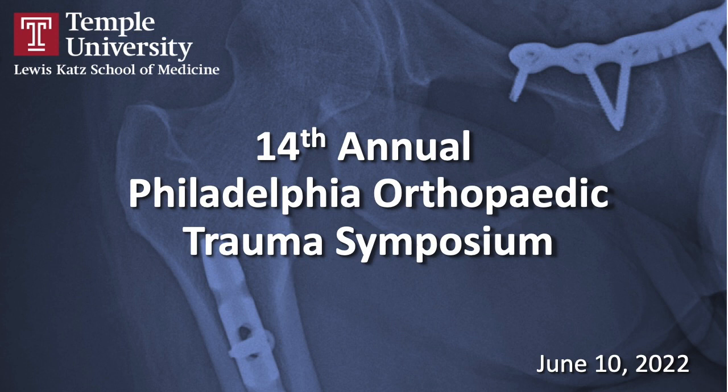That's critical. Okay. In my world, it's partly driven by what the pin sites look like. If you've got a bad-looking pin, that's probably a problem. But if they all look pristine and you've got an A host, a good host, I'll put them on 3 to 4 days of broad-spectrum oral antibiotics, and I'll do a one-step exchange. As long as it's an A host and all the pins look good, that's a controversial thing.